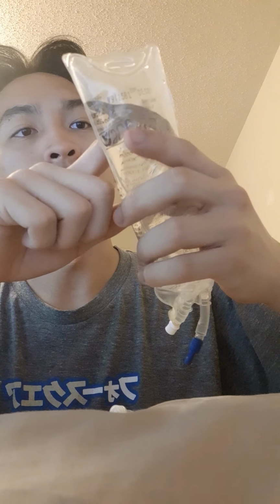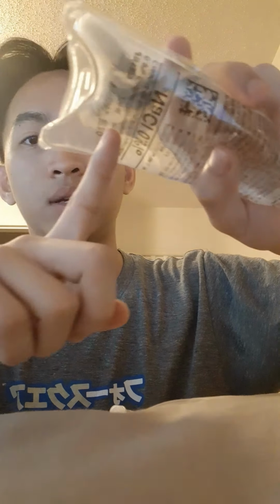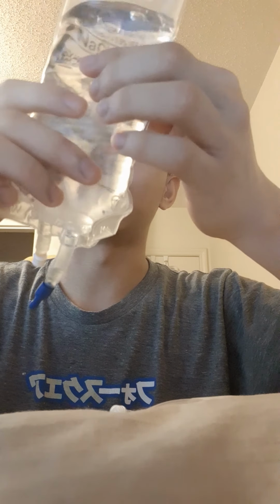And I'm going to check if there are any abnormalities to this saline bag. For the purposes of this video, this is a used saline bag. I've used it for practice. And I'm going to check the expiration date over here. I'm going to assess if there are any leaks, if it's cloudy. I'm just going to check if there are any abnormalities to the bag.